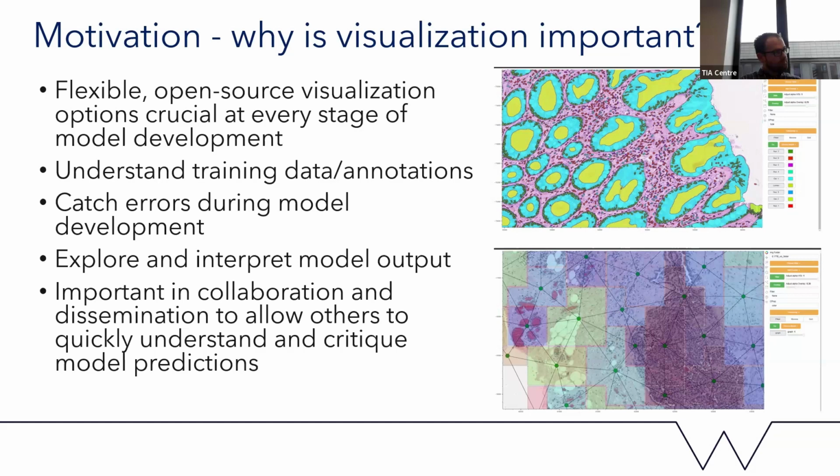And obviously, once you're getting towards the end of your model development, you want to be able to explore and interpret the model output and correlate it with what you see on your whole slide image. And in collaboration and dissemination, it's obviously very important to allow others to quickly understand and very importantly critique your model predictions.